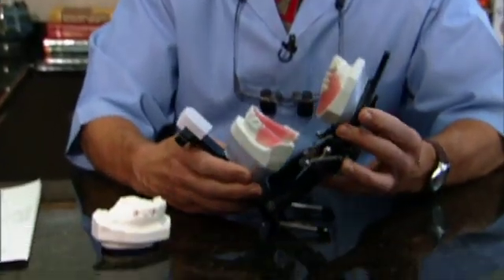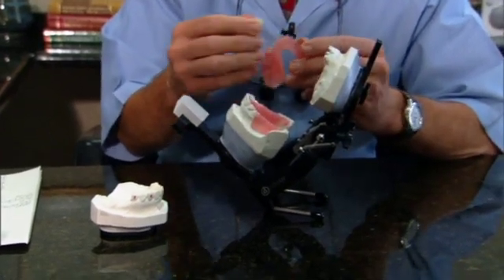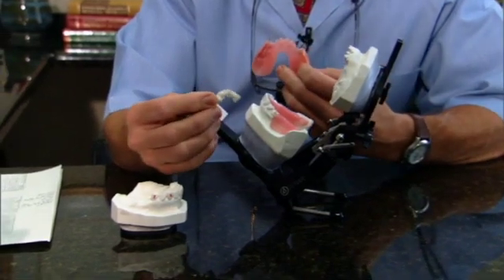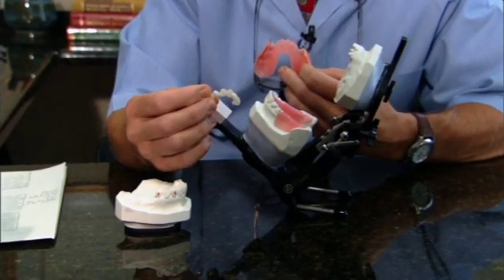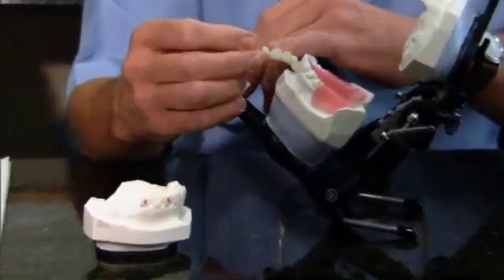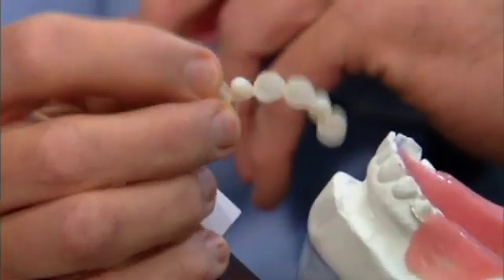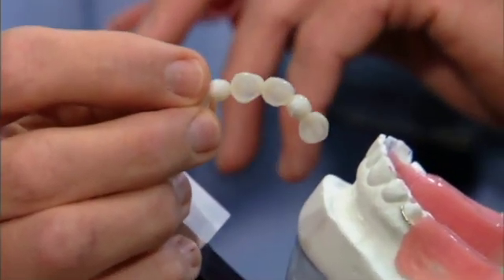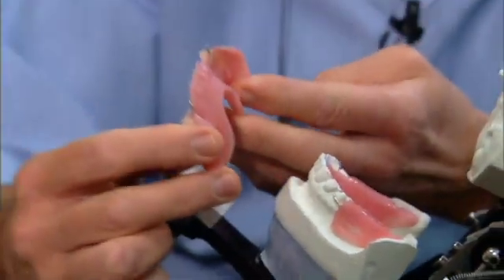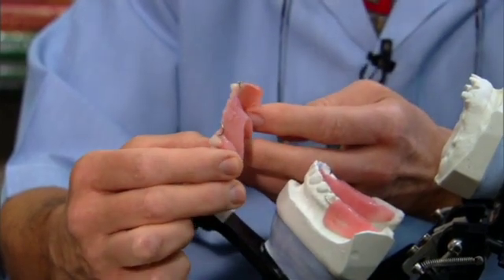The laboratory has fabricated for us provisionals that we'll be able to insert today. We have a 6-unit temporary bridge, provisional bridge, that will serve as a healing guide for our grafted areas in the position of 7 and 10. We did not make it in 2 pieces, simply for stability. Also, they have fabricated a temporary partial with wrought wire gold clasps to replace our posterior teeth.